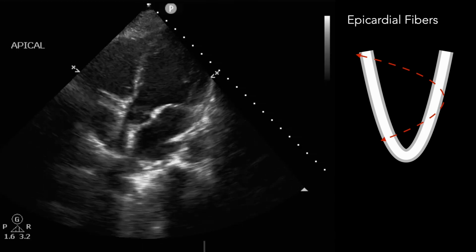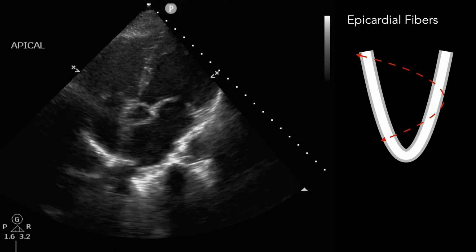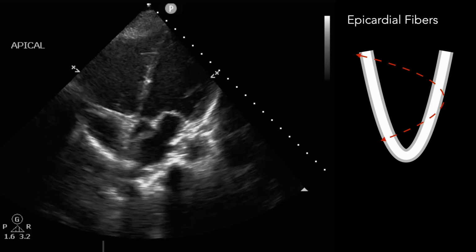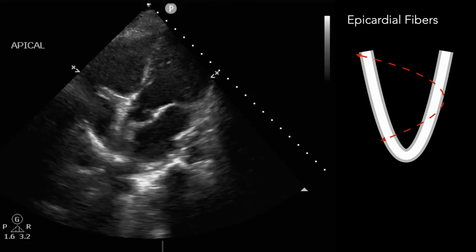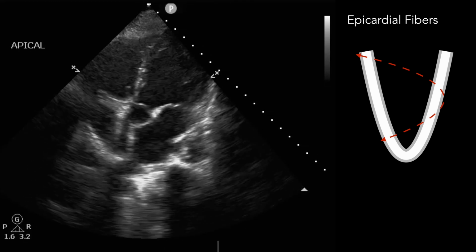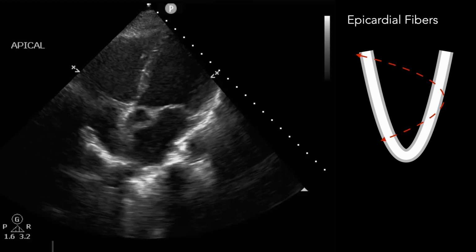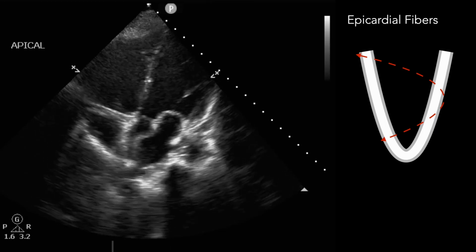And I'll say it now in case I forget to say it later. The fractional shortening is measuring one dimension, right? It's measuring that radial squeeze of those mid-wall fibers, and it's correlating that with the other two, or it's assuming the other two dimensions are consistent, and really estimating that to be consistent with the ejection fraction. So what we have to realize is as we go into the actual three-dimensional geometry, it's a lot more complex than one dimension will say. And so this is where some of the pitfalls of the fractional shortening come in.